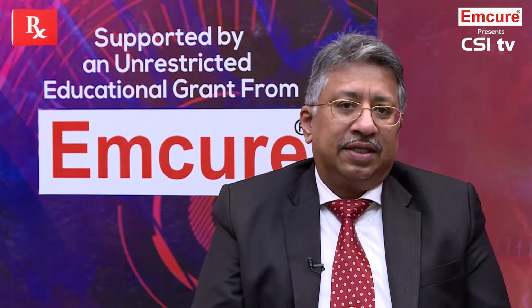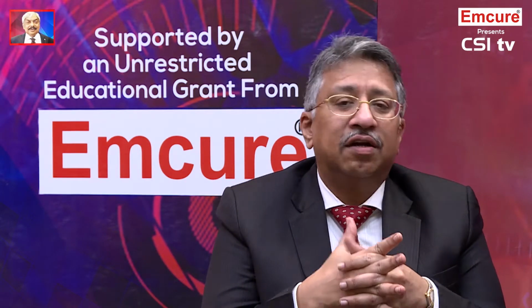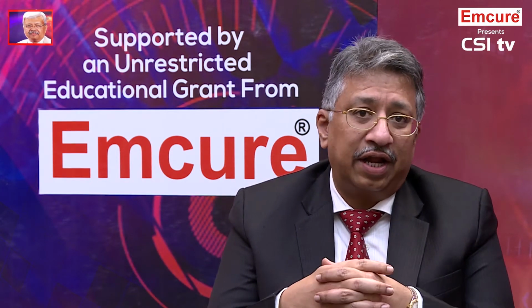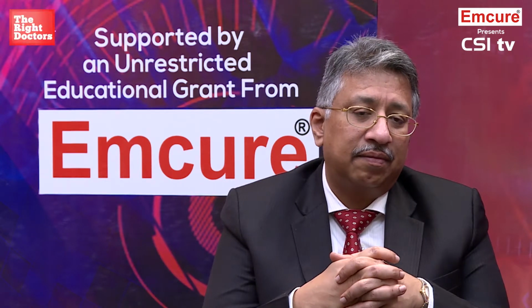Right, sir. So, sir, what will be your final key message to the Indian cardiologist for left main stenting? See, my message is that if you have an intermediate left main lesion, we must do a fractional flow reserve to determine if that lesion is functionally significant before we decide whether we should send the patient for a bypass surgery or an angioplasty. I think it's part of the appropriateness of a left main revascularization.